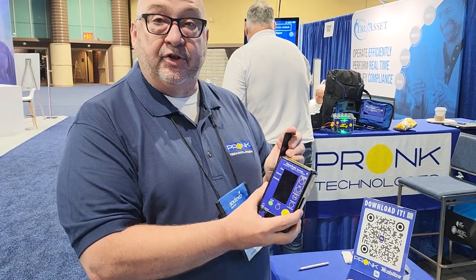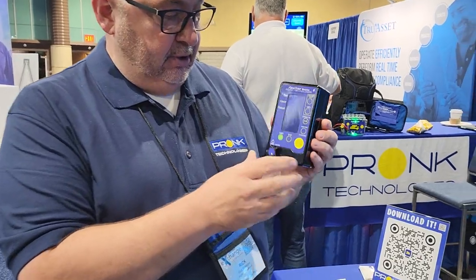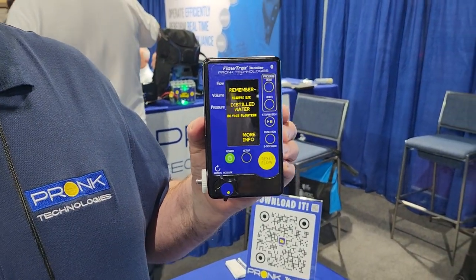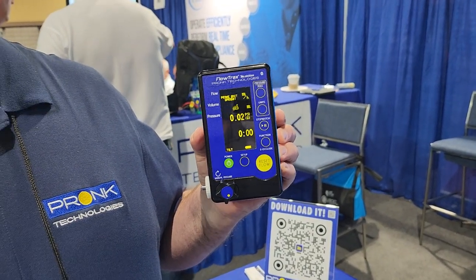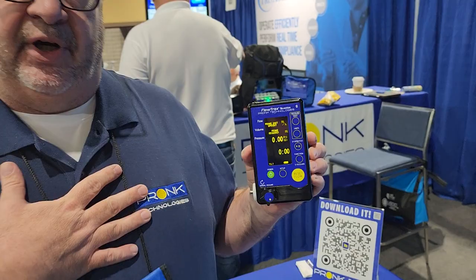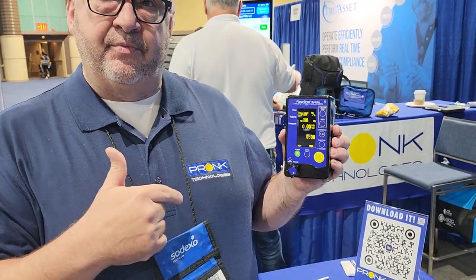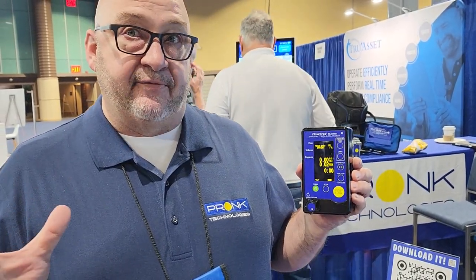I would refer to the quick reference guide that we give you — if you don't have it, they're available for download on our website. There are a couple of ways to prime this. You can use a syringe, but my favorite way is with an infusion pump. After cleaning the glass, I would hook an infusion pump up to it at about a 900 rate — a really fast, aggressive rate.